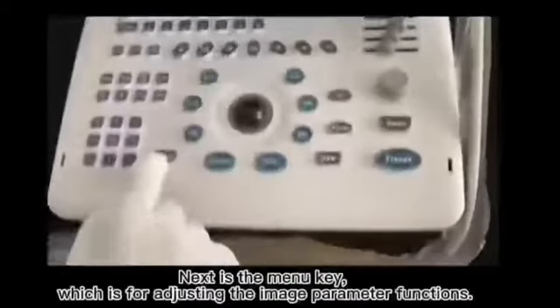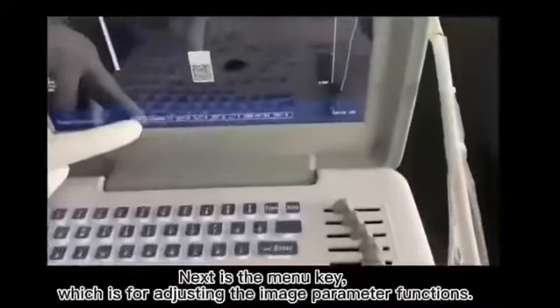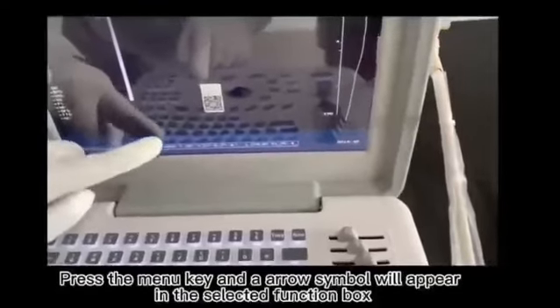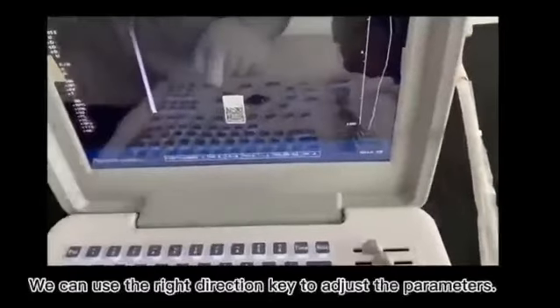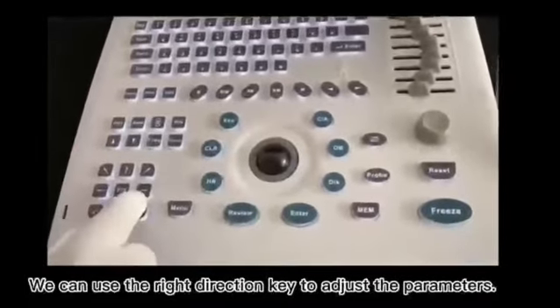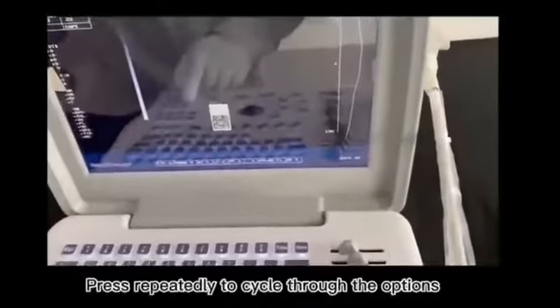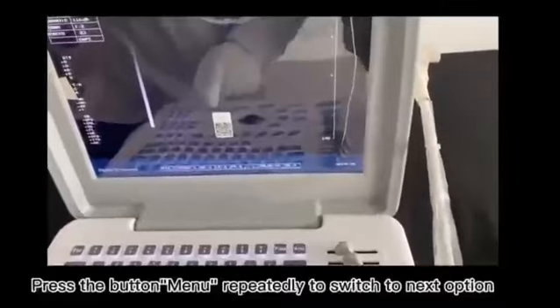Next is the menu key, which is for adjusting the image parameter functions. Press the menu key and the arrow symbol will appear in the selected function box. We can use the right direction key to adjust the parameters. Press repeatedly to cycle through the options. Press the menu button repeatedly to switch to the next option.